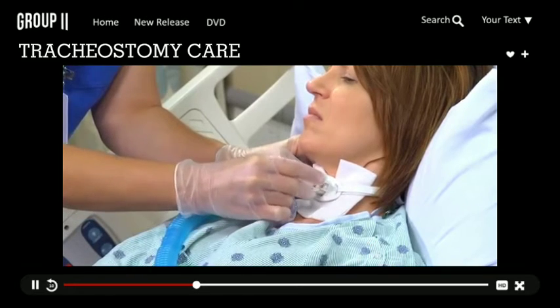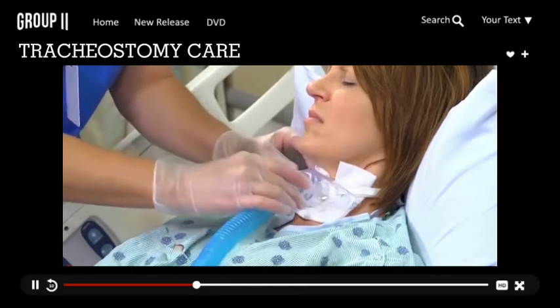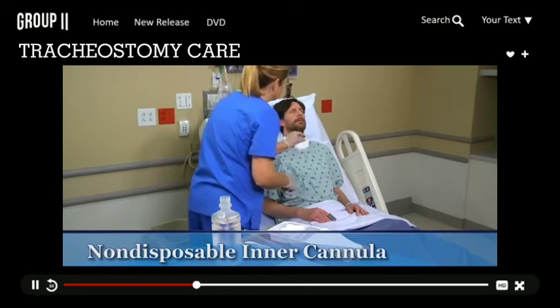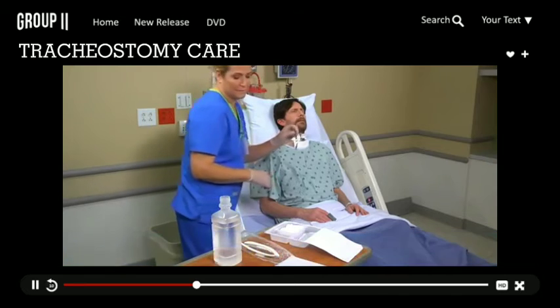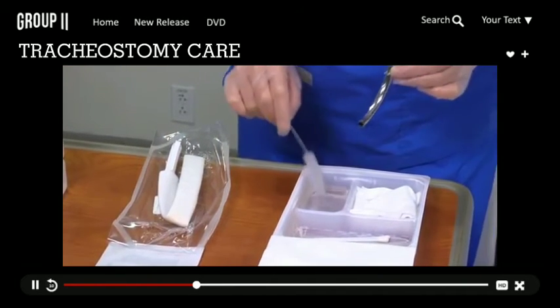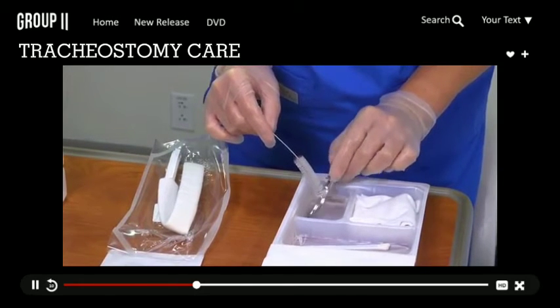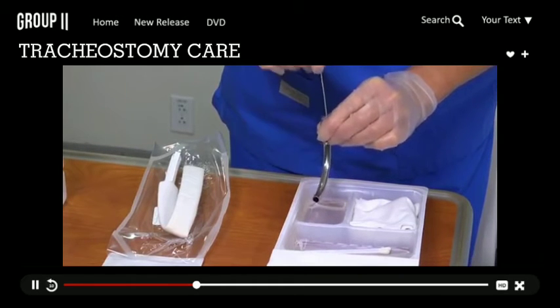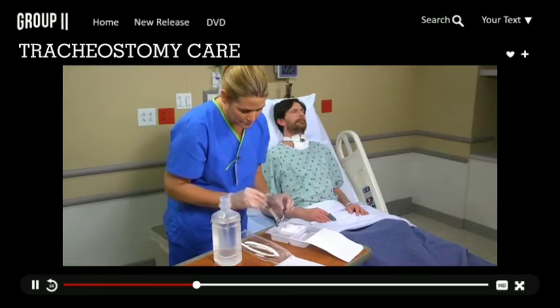If necessary, reconnect the patient to the ventilator or other oxygen source. I'm going to clean out your inner cannula. If the patient's tracheostomy has a non-disposable inner cannula, use your non-dominant hand to unlock and remove it. Use strict aseptic technique. Touch only the outside of the cannula and drop it into the basin of normal saline. If necessary, replace the oxygen source over the outer cannula. Pick up the inner cannula and use the sterile brush to remove secretions from it, both inside and outside.